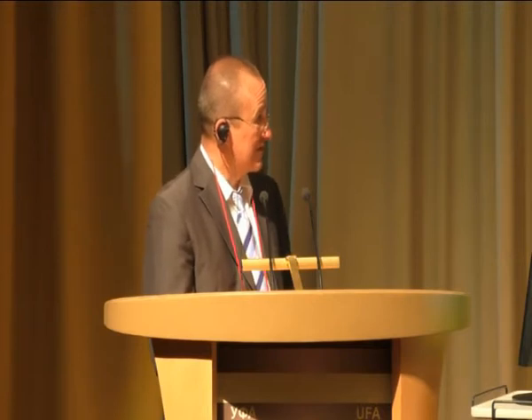This time I will be talking about the results from the project where I'm working for 20 years now, and we try to get blind people into a situation where they can see again with electronic devices, with this subretinal chip.